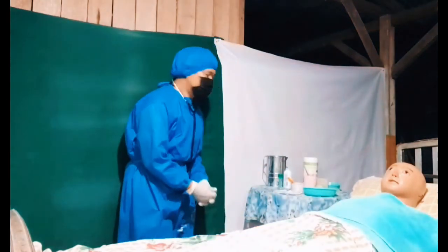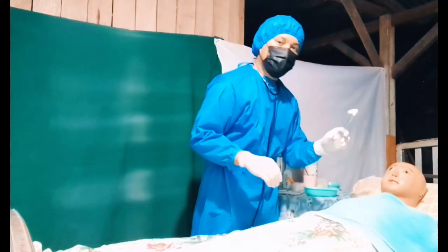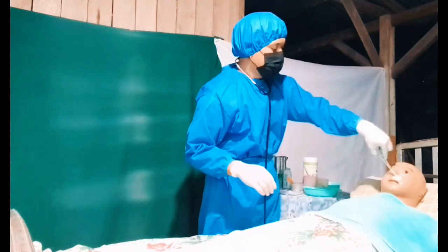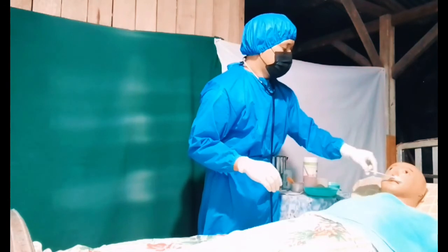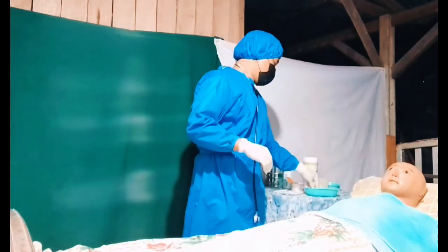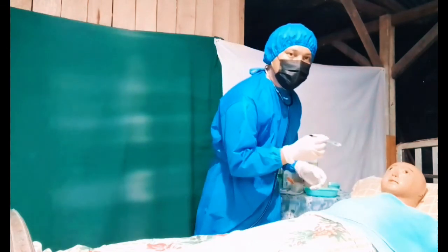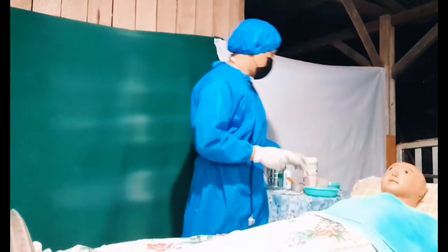Quickly dispose of the tube. And then wipe the wet cotton on the patient's face, in the nose as well as the lips. And then check the nose if there's any damage. If not, that is good. Fold the towel.